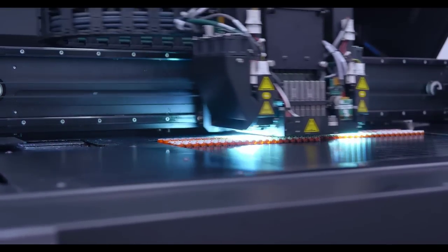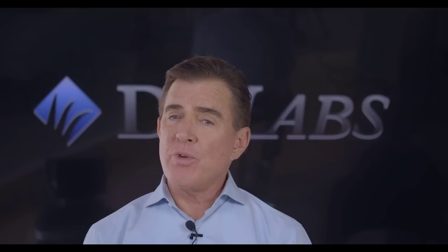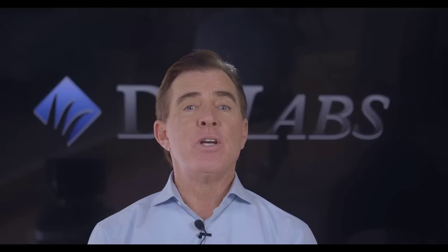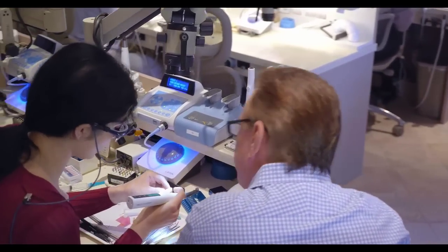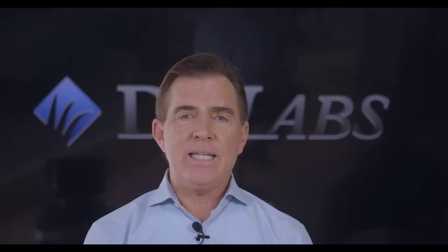I'm talking about inventing 3D printed procedural training replicas of authentic human anatomy so dentists can learn hand skills iteratively and definitively without involving humans or human parts. True Tooth and True Jaw 3D printed replicas from real human anatomy provide a realistic hands-on experience and control the learning objectives to allow the clinician to achieve mastery of a specific challenge with routine practice. And as inviting as the financial savings may be, remote hands-on training has the undeniable advantage of training in your office with your assistant.